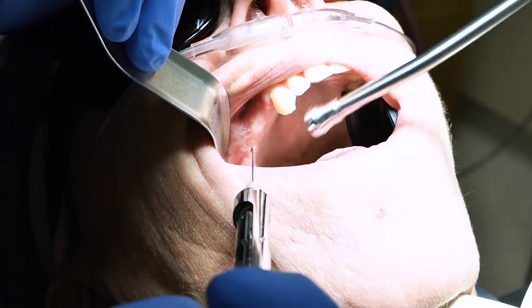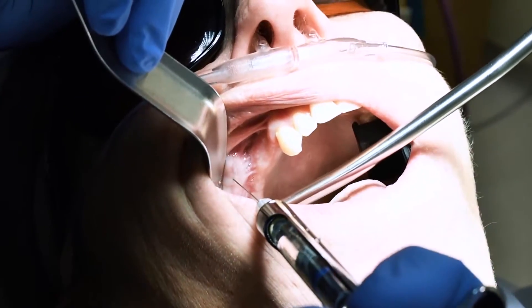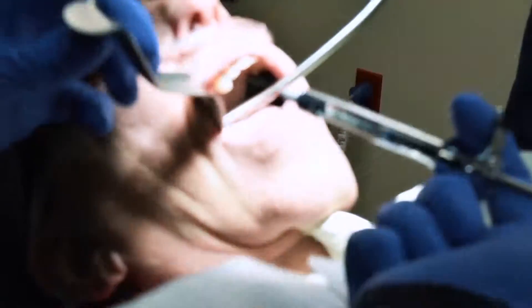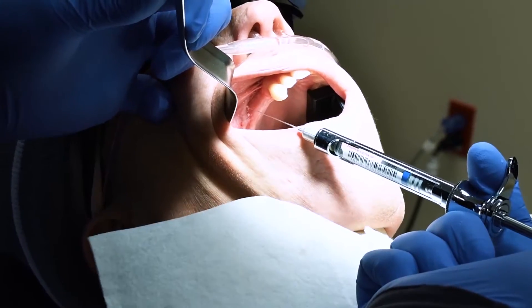In the number five area, an implant in number three, and then there's some hardware up in here from a previous injury. The first thing I'm going to do is start giving some numbing medicine in these areas. So right here is the infraorbital nerve. I'm going to put my needle right in that area and put some local anesthetic in there.